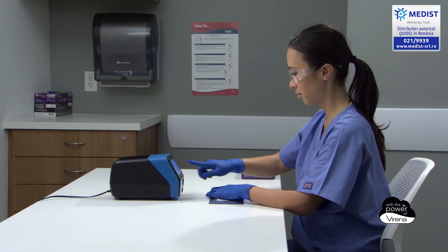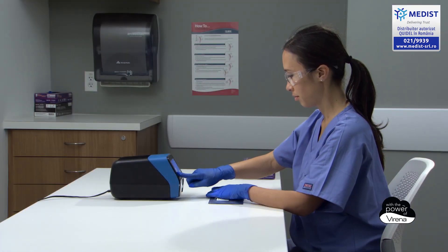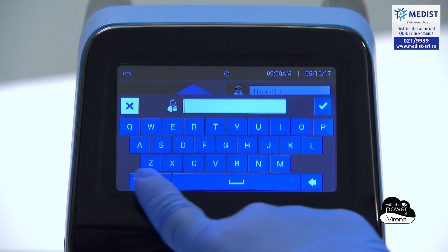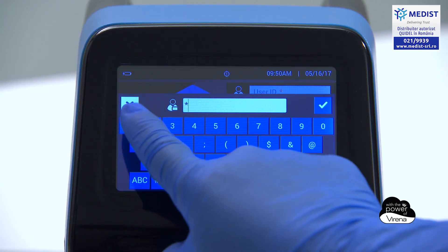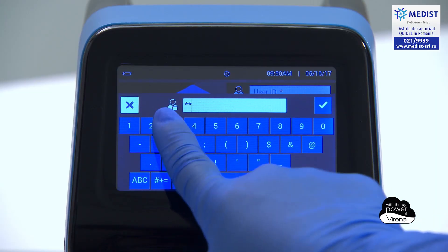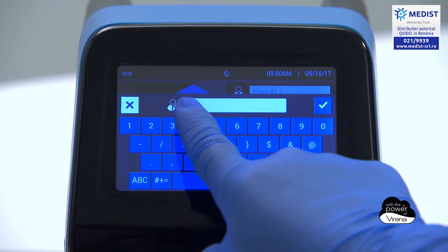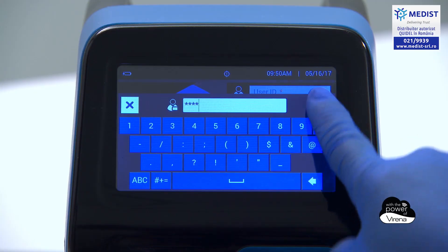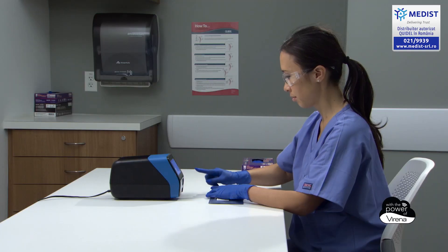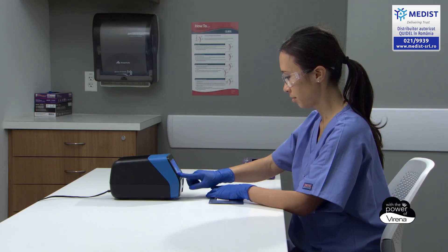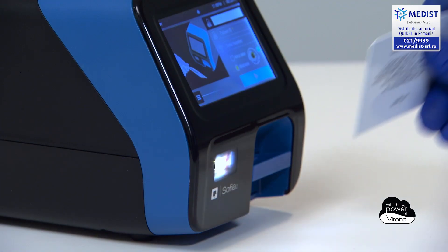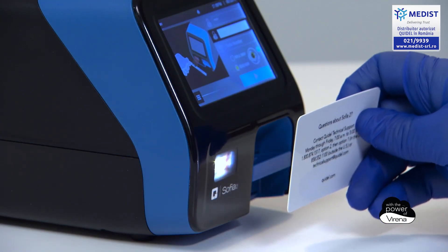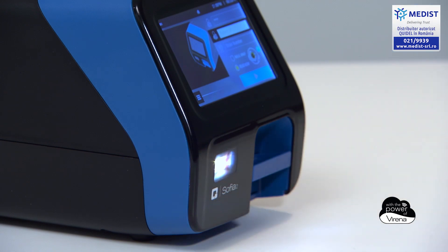For easy data recall of test, calibration, or QC history, operators can enter their user ID and patient or sample IDs using the full-color touch screen or integrated barcode scanner located on the front of Sophia2.